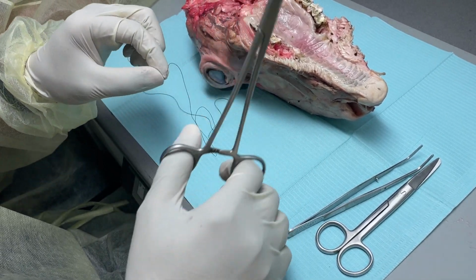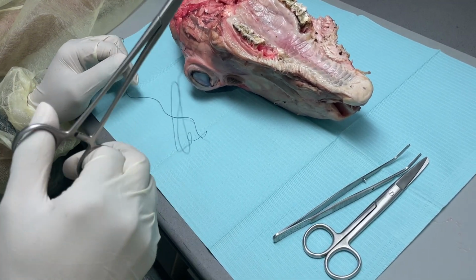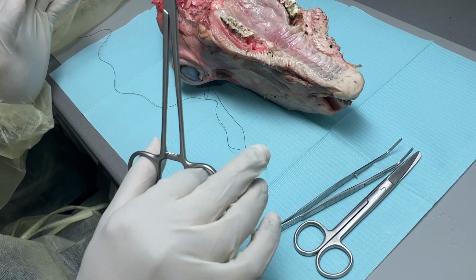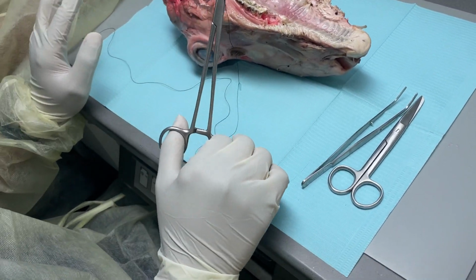After you lock it, doctor, you can change the position of your hand. I can, no problem. You don't have to hold it, you don't need to press all the time. It's locked. Now I don't have to do anything. I don't have to worry about holding it together.